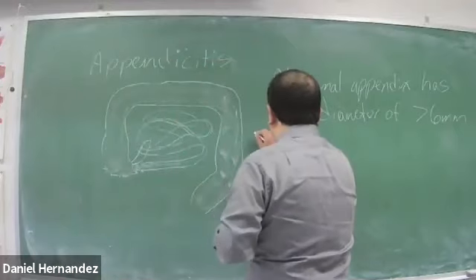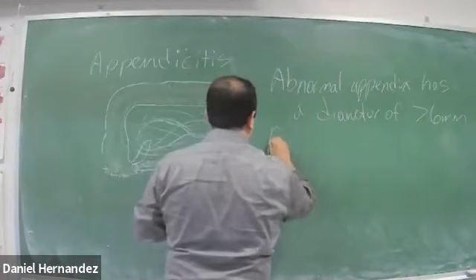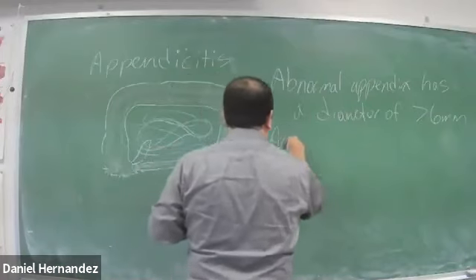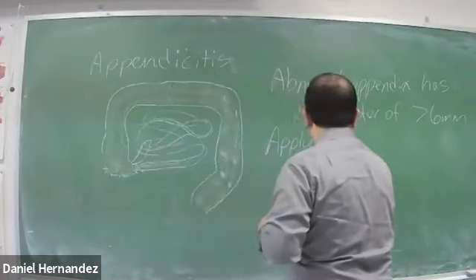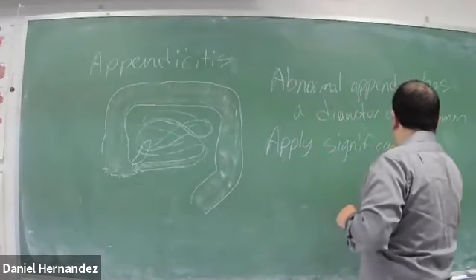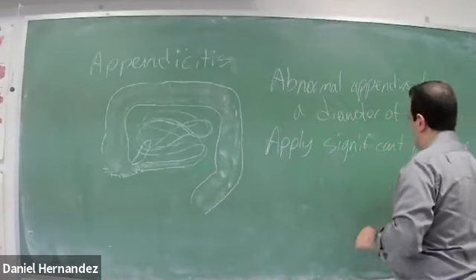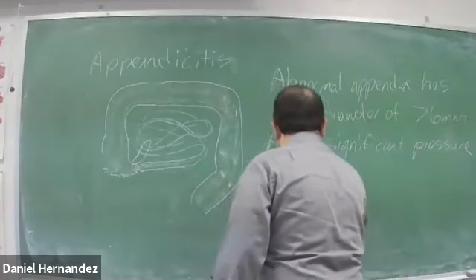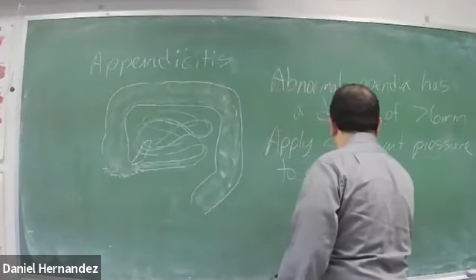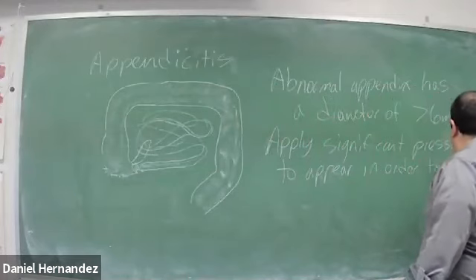And another thing also is that we have to apply significant pressure to an area to visualize.